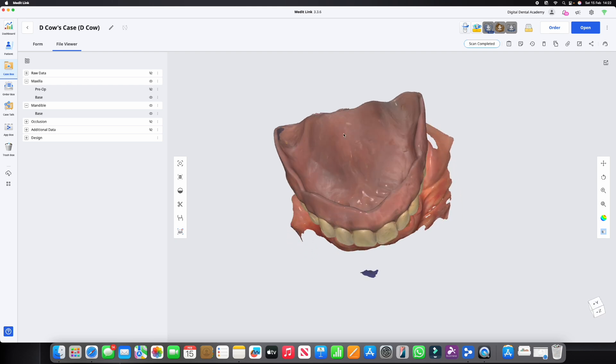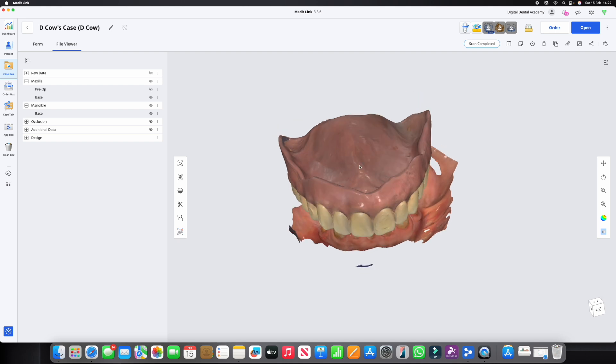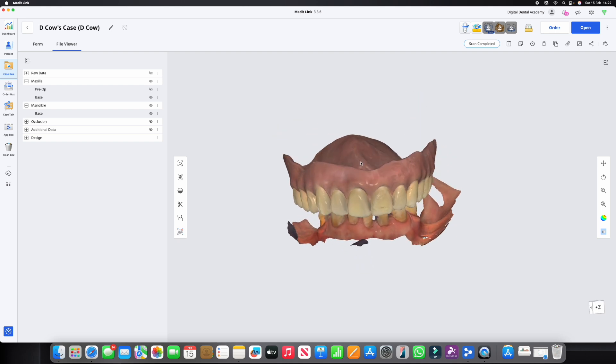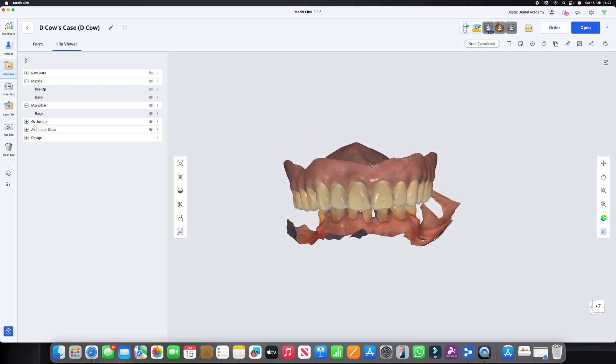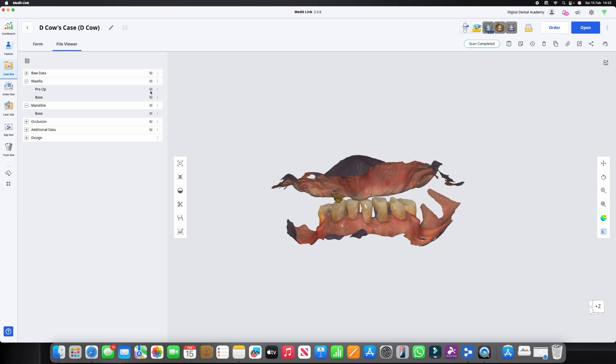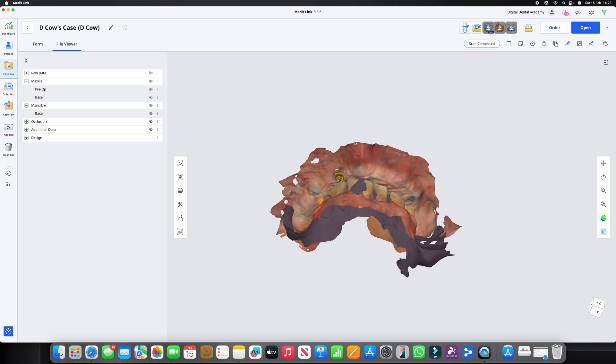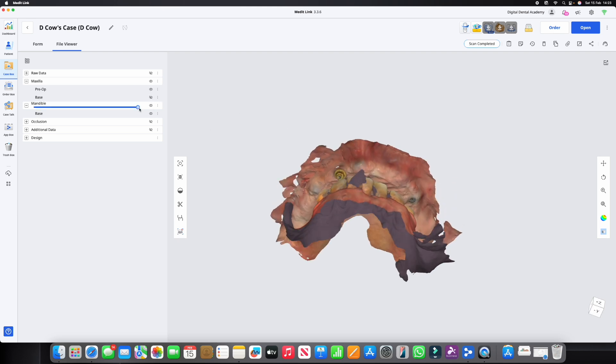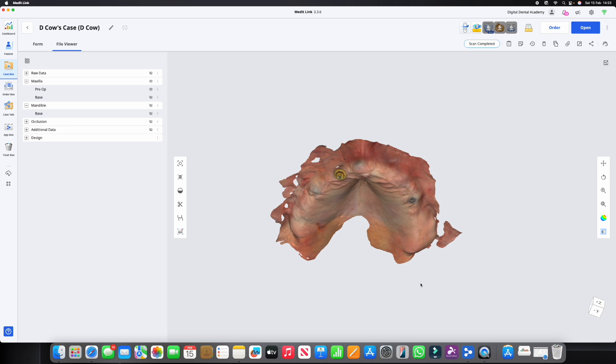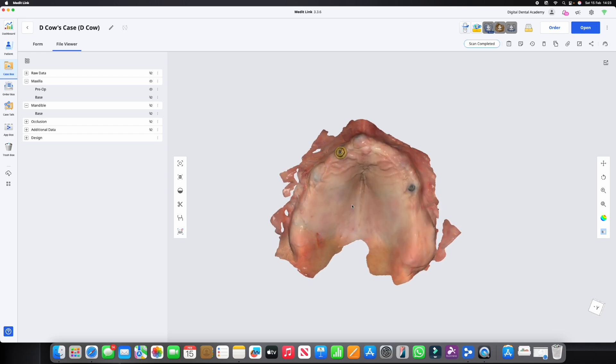The common question you see online is how do we then match up the fitting surface and also the scan ladder surface. If I turn this off, turn this on, and I'll turn the mandible off, so you can see we've got the additional data scan, the scan ladder scan, which I have matched up with that denture scan.